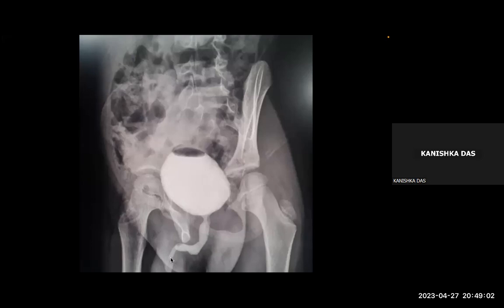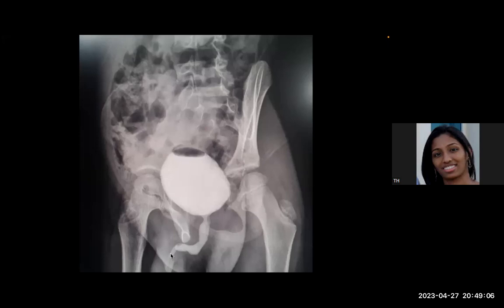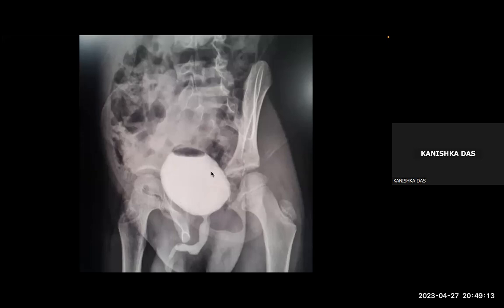Till somewhere there. Then you see a narrow stream. Okay. All this is dilated anterior urethra. And then this is the bladder. So you didn't tell me about the capacity of the bladder. Normally we fill up to the sacral promontory during MCU. Correct. So we calculate accordingly.